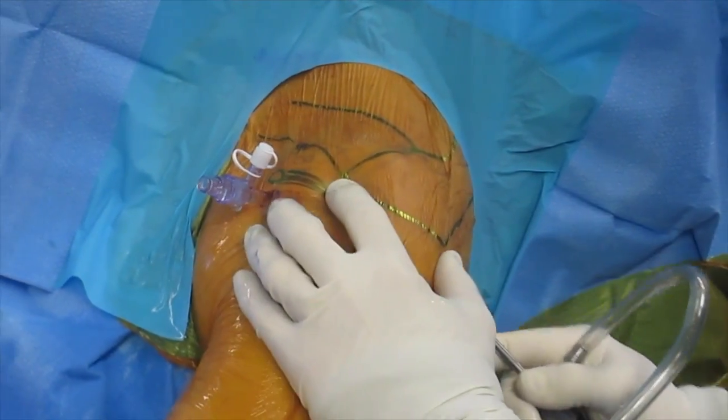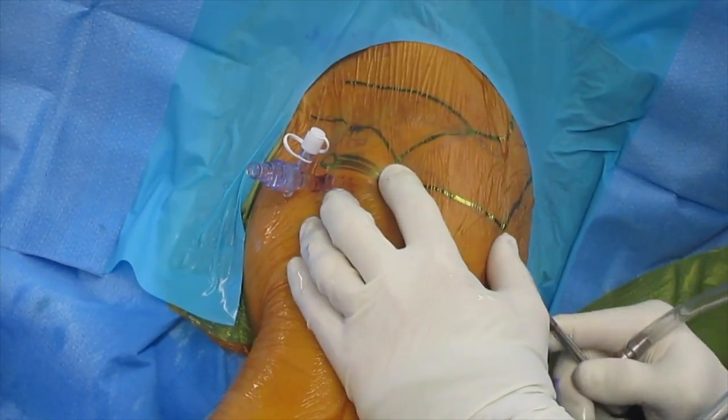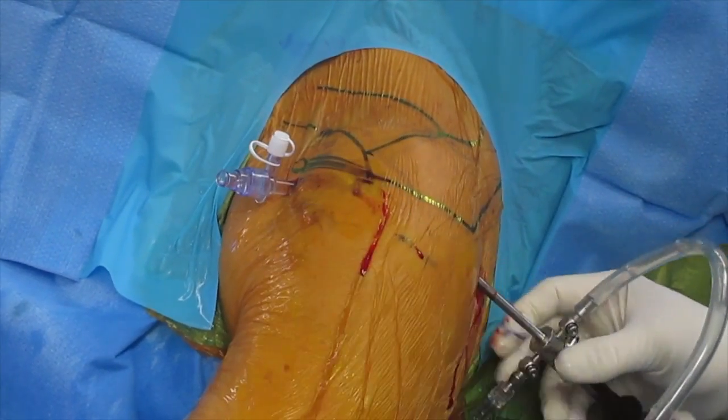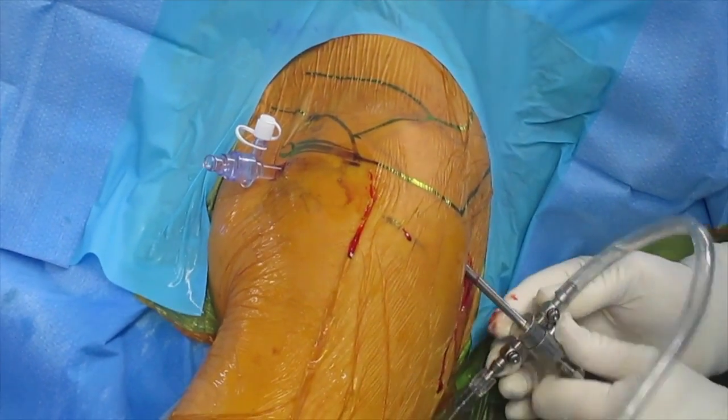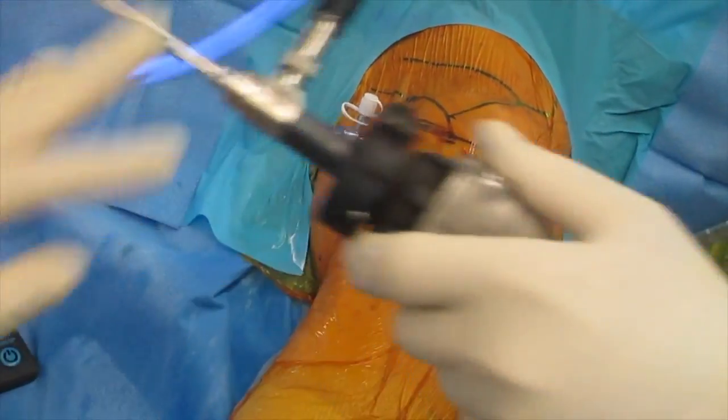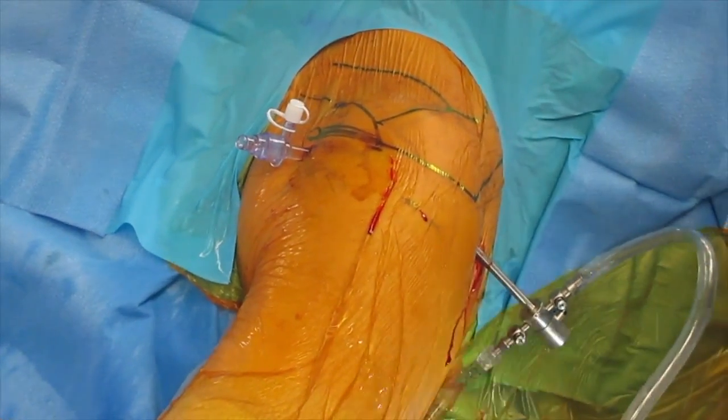Because the fibers of the infraspinatus and the deltoid are oriented orthogonally, this plane can be identified by free movement with subtle superior and inferior movements of the tip of the trocar. The trocar is then advanced in this plane, aiming towards the anterior lateral corner of the acromion and towards the coracoacromial ligament.